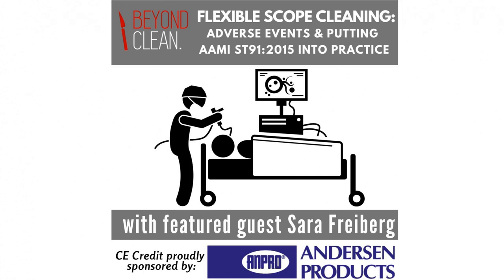Sarah, it seems like, especially when we're talking about flexible endoscopes, one of the most common instructions in any IFU, whether you're talking about flexibles or not, is visual inspection, right? You see it over and over and over. It has to be visually clean. But yet, when it comes to flexible endoscopes, we kind of just assume that if we do all the right steps, everything on the inside should be clean. It's very difficult to ever say with any certainty if you can't look at it.